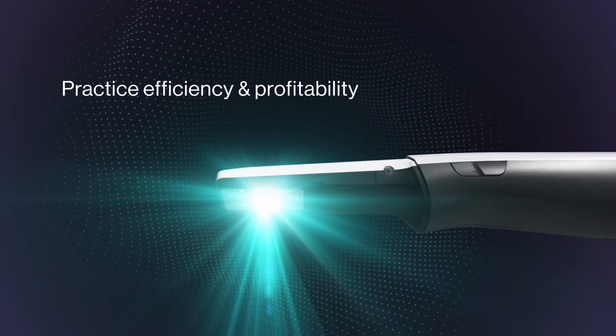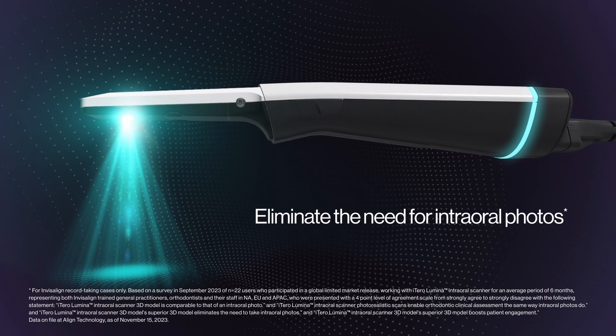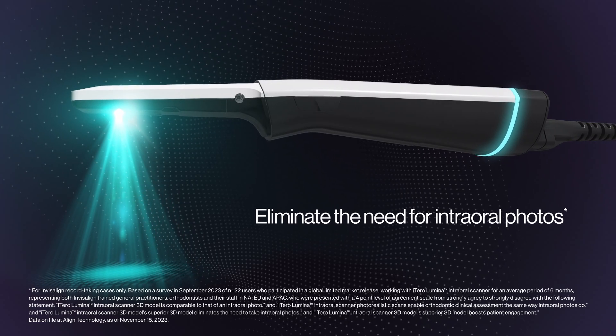Imagine how much time you could save when you eliminate the need for intraoral photos, optimizing time-consuming steps.